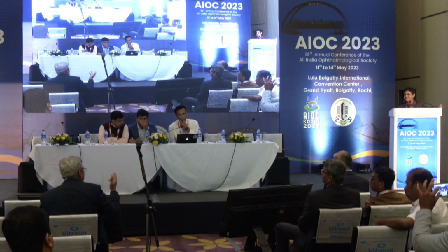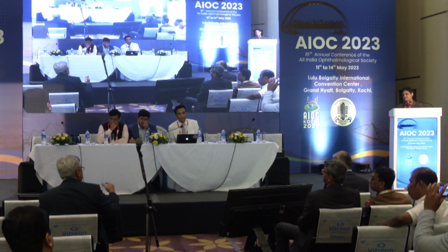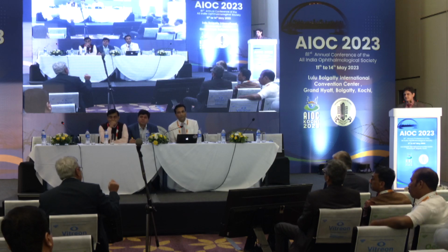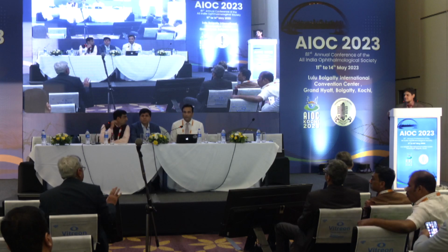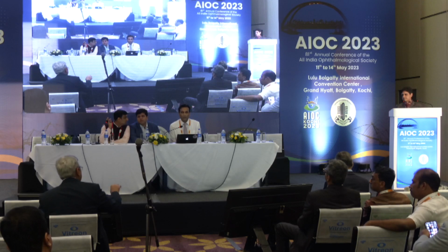I personally think, whatever I have done, because numbers are not very high with me, that I cannot say that this is the best. Initially, we used to do laser, but my main concern is that if the patient has more than 6/12 vision, I don't touch this eye at all. You see, all eyes with pit and with schisis or elevation in the macula should not be touched, because I can't take them from 6/12 to 6/6. Very difficult. So my take will be that apart from what you do, PVD, you should not peel the ILM. You have to take ILM from the nasal side and put it over.